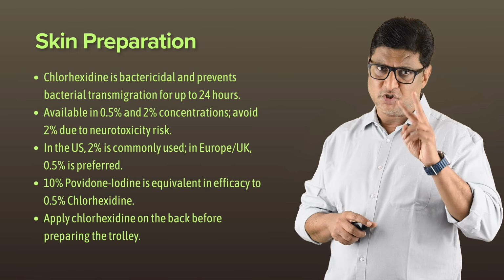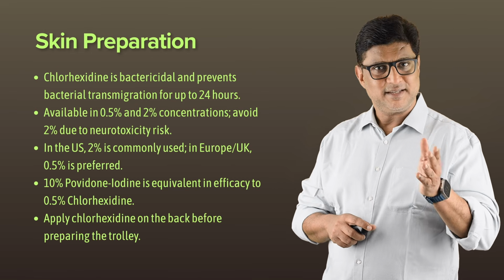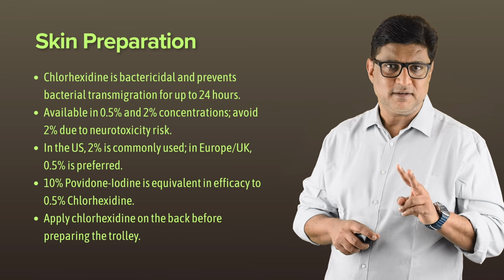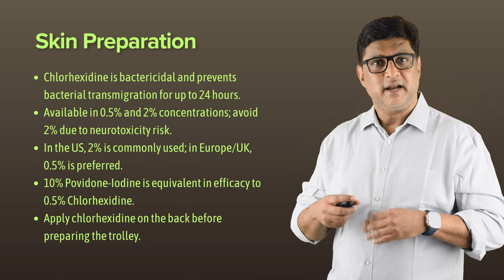Chlorhexidine is available in two concentrations, 0.5% and 2%. But here is the key. Do not use 2% because it is considered neurotoxic. So the sequence is, first paint the back with chlorhexidine, then continue with your trolley preparation. What do the guidelines say?